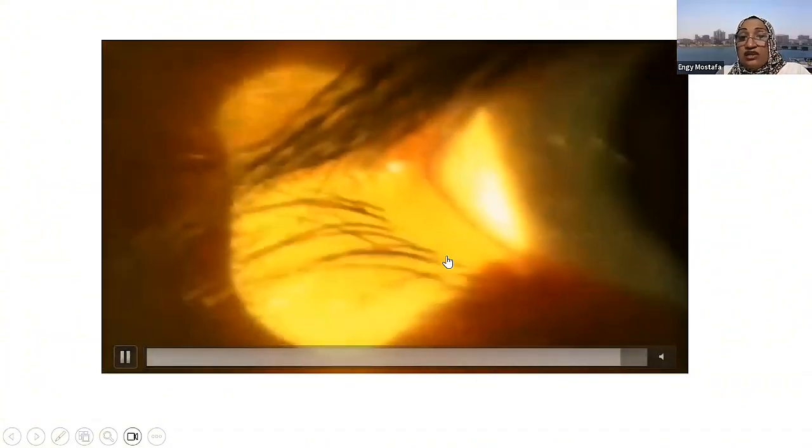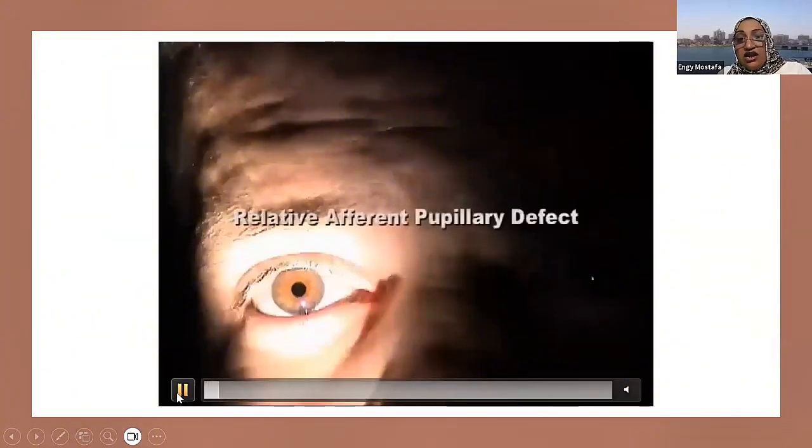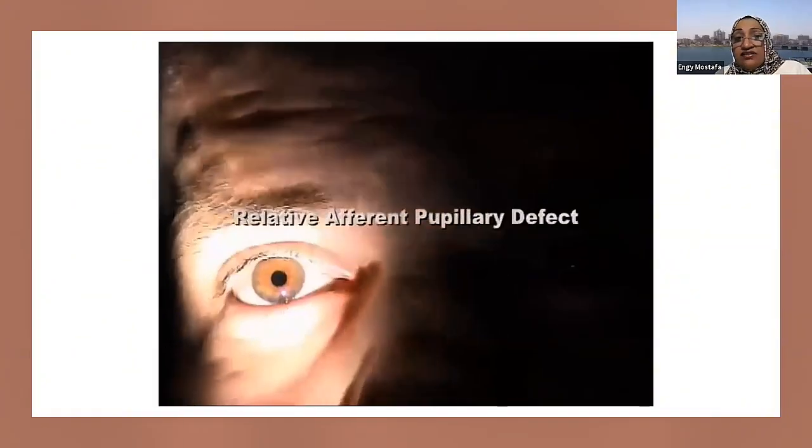So especially if the complaint of the patient would be like grittiness, foreign body sensation, and otherwise. While we are at this, we should remember to examine the pupillary reflexes. We have to state that we have to be very systematic during an examination so that we do not miss an item.